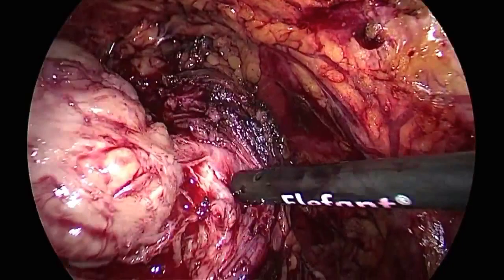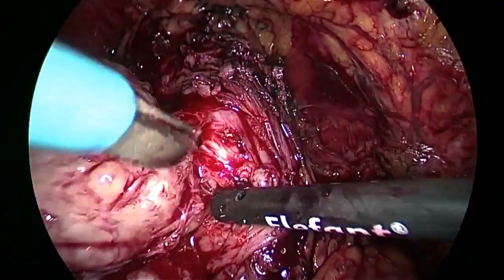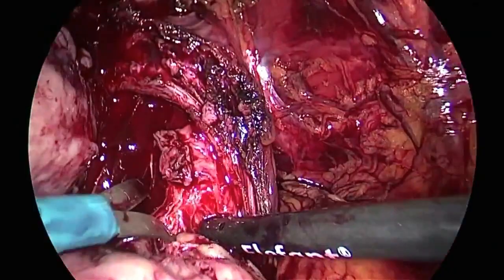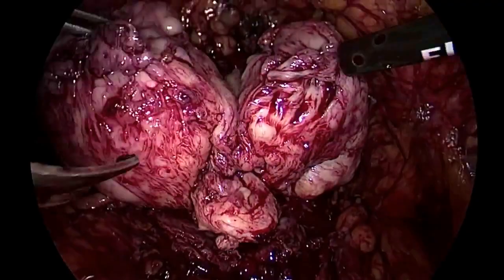At the beginning of my experience, obviously, the risk is to perform an incision here. If you don't find the plane and you perform an incision here, there is a big risk of bleeding in the postoperative state. So this is very important: to dissect and to find the dissection plane between the adenoma and the capsula. Okay? It's very, very important. This is the most important point that I'd like to emphasize in order to prevent bleeding. Okay, this is the adenoma.